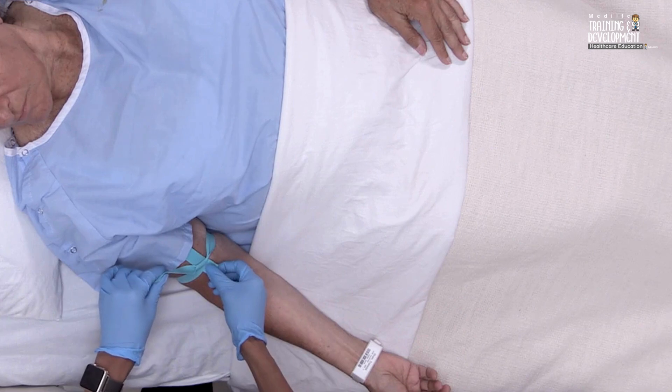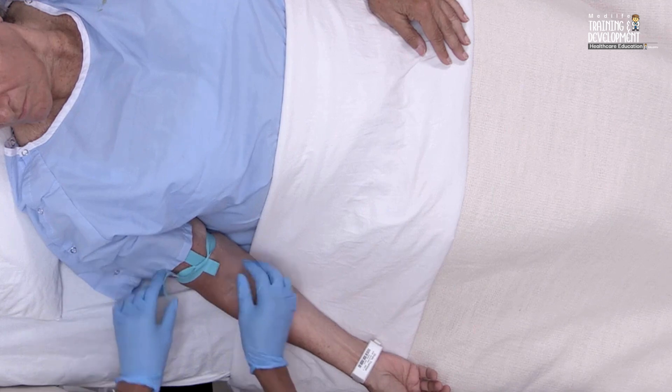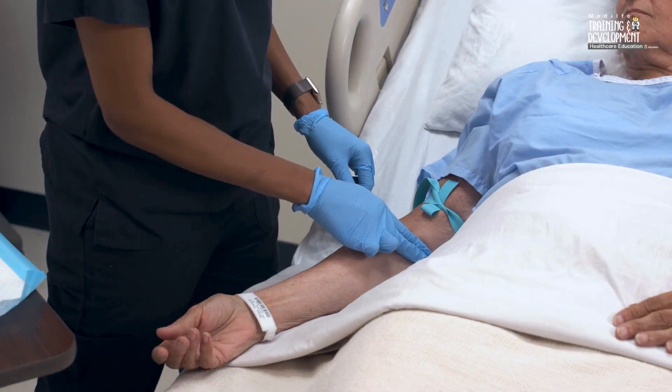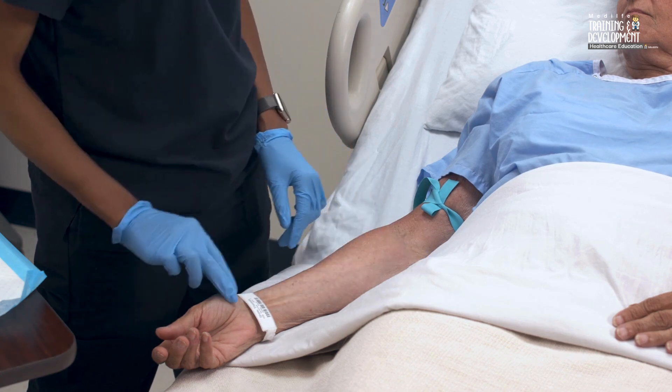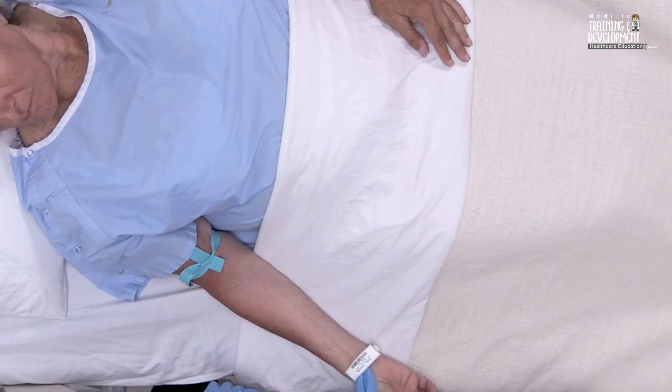To prevent pseudohyperkalemia, don't ask the patient to tightly clench or repetitively open and close the fist. Limit tourniquet application time to less than 1 minute to prevent hemoconcentration of the specimen. If a tourniquet has been in place for longer than 1 minute before accessing the vein, release it and reapply it after 2 minutes before performing the venipuncture.